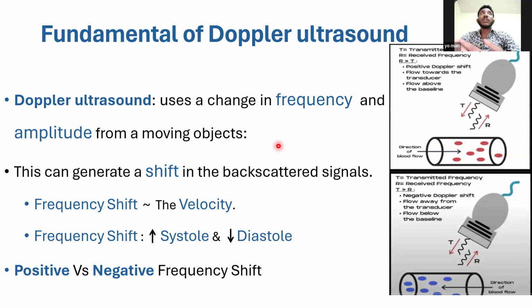As a common rule, you should also know that the frequency shift is increased in the systolic waveform, because the systolic waveform is derived from the pumping action of the heart, while the diastolic is created due to the resistance from factors encountered when the blood passes through the blood vessel. So the frequency shift is not that much in diastole when compared with systole.